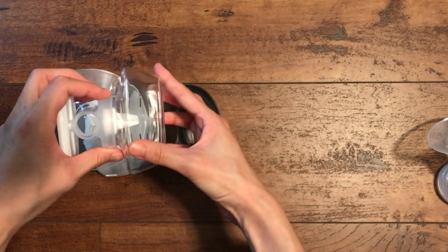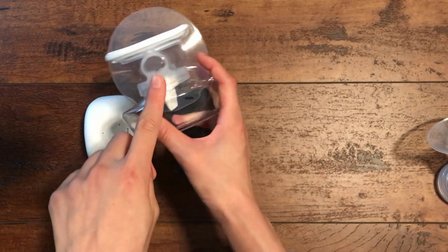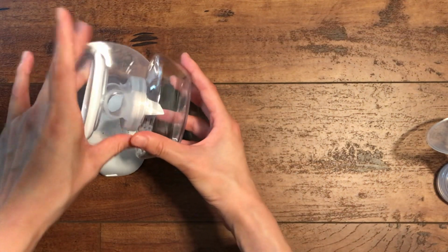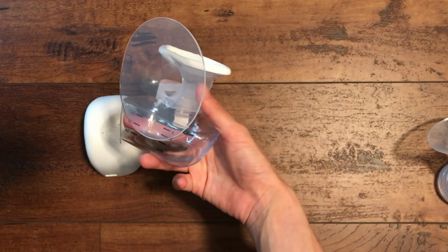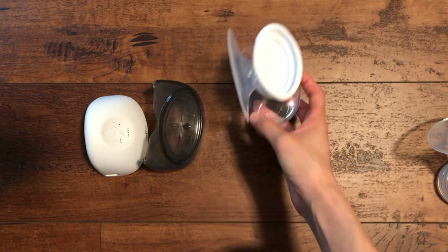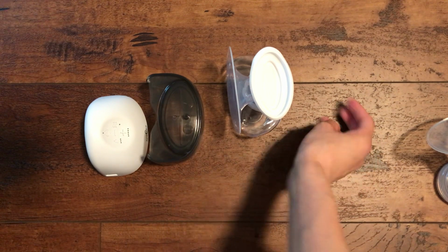With another competitor brand wearable pump like LV, I know they have this clicking button system where you take the bottle off and then you can click it on, and that kind of felt more secure to me. With this one, just make sure you hold on to the bottle when you handle the pump after the pumping session, because I have read in some blogs that some people have had spills before, so be careful.